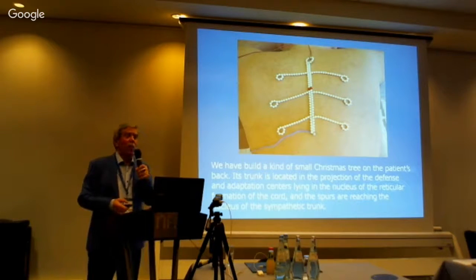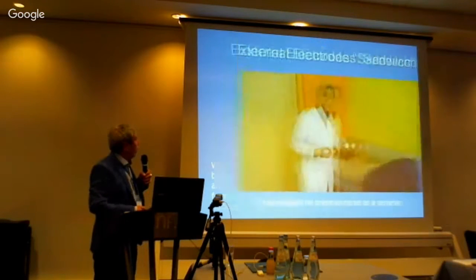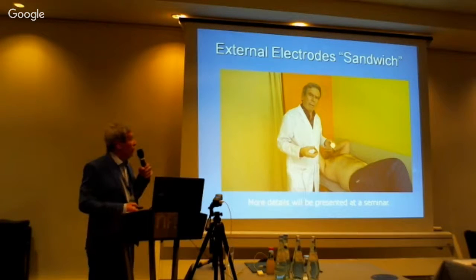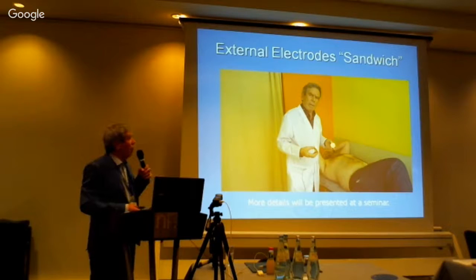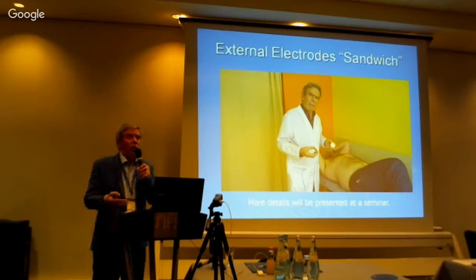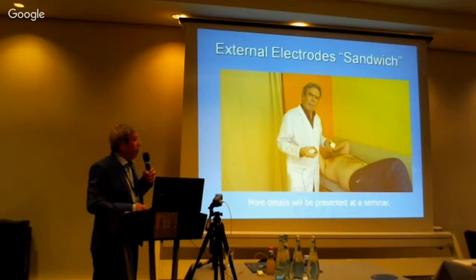I have a couple of these electrode sets. I can show you them, and this is the way we use the sandwich electrodes. The electrodes are produced in Tomsk, and we use them to treat quite different diseases. And in this particular case, we observed that while palpating this pain, we could see that it was reflected in the back.